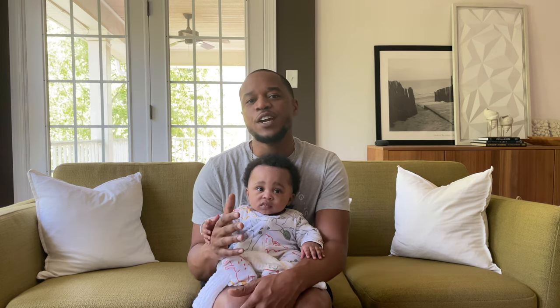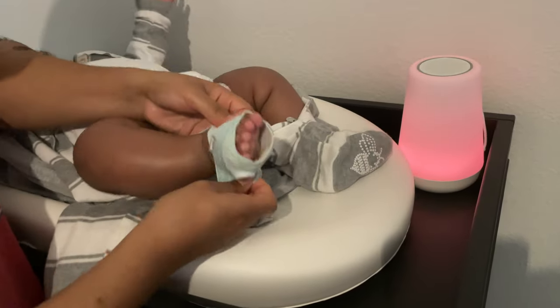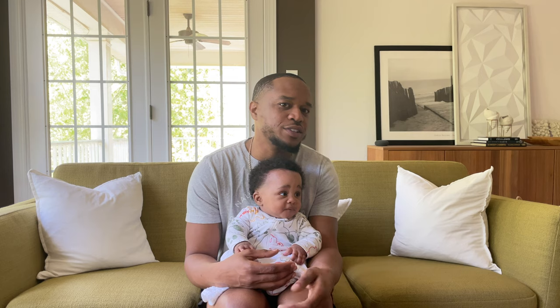Which brings me to design. Once we figured out how to put the sock on, it's actually pretty simple, and we appreciate the velcro straps that come with it, which allow you to customize the fit exactly to your baby's size so you don't have it too tight or too loose. Too loose and you risk it falling off or getting out of position, and sometimes the app will tell you it can't calculate the readings properly — but when you open the app on your phone, it will also tell you how to adjust that.